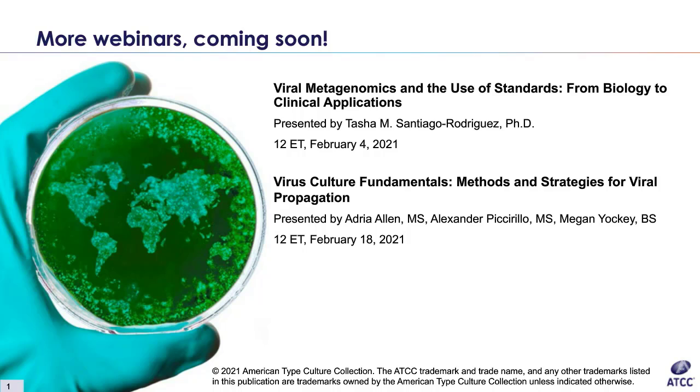I used ascorbic acid as a part of a medium formulation for growing primary cells. So they were bovine primary adrenal glomerulosa cells, and the ascorbic acid was added as a free radical scavenger. So basically it's like why you would add it to anything.